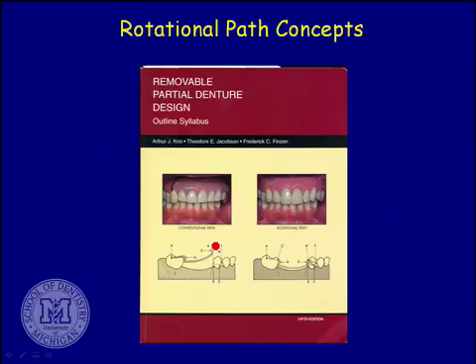In the upper case, as shown on the cover of your book, if you've got an upper class 4 partial denture replacing anterior teeth, one of the downsides is the clasp. I would argue the clasps on this particular partial look reasonably good, in that the clasp is an infrabulge clasp, so it stays up high and contacts the tooth very near the gingival margin, so it's not an extremely ugly clasp as clasps go.